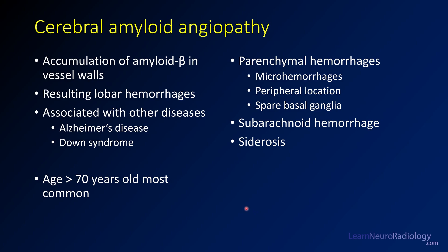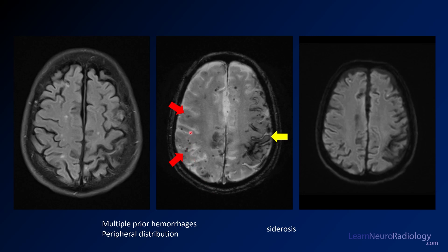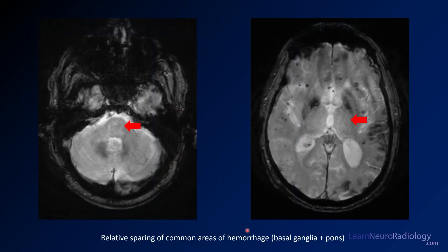This is a case of cerebral amyloid angiopathy, which is an abnormal accumulation of amyloid in the vessel walls. As a result, you get these lobar hemorrhages, and they're often peripheral at the gray-white junction. They tend to spare the areas that you see in hypertensive hemorrhage, so you see less in the basal ganglia and less in the pons. Most frequently, these patients are going to be over 70 years old — as in this case, this patient was 80 years old. The red arrows denote these peripheral hemorrhages at the gray-white junction, and you see the siderosis on the contralateral side, coating the brain, with relative sparing of the pons and basal ganglia.